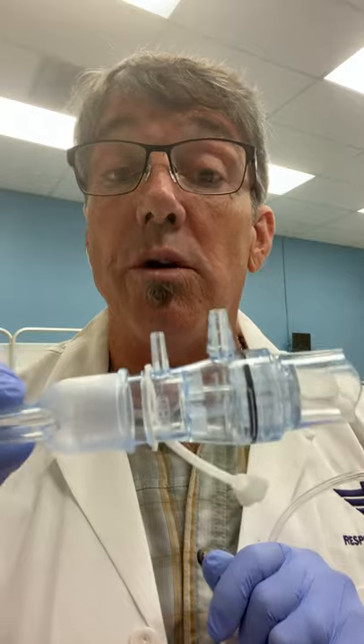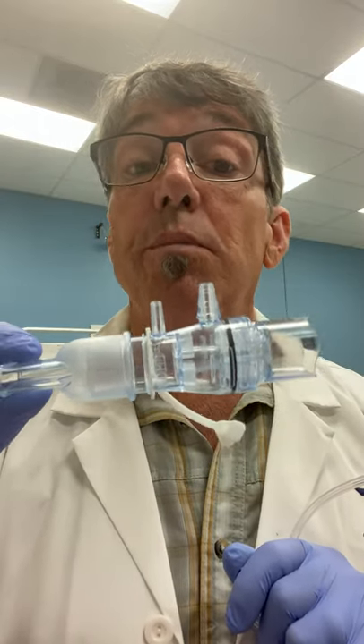Today we're going to look at the EZ-PAP and we actually require flow to make the EZ-PAP work. We need an oxygen or an air source to make the EZ-PAP work.